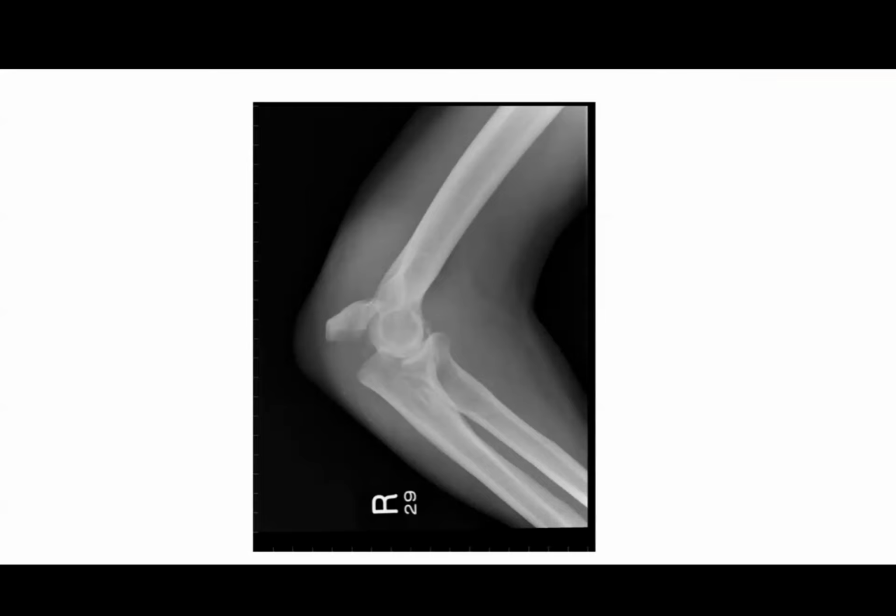Okay. You described everything, but make sure to mention this is an elbow. You didn't mention anything about an elbow. And also, when you say you're worried or concerned about a fracture, don't dig a hole for yourself, so just don't mention it. Yeah, this is displaced, with no comminution, so you described the X-ray. Well done. Also, before we go, you can mention something about soft tissue swelling around it, so this could be a hematoma around the fracture site. Yeah, thank you. Who's going to go next?